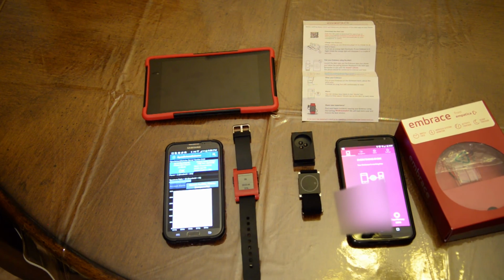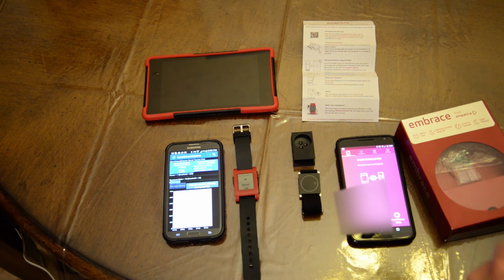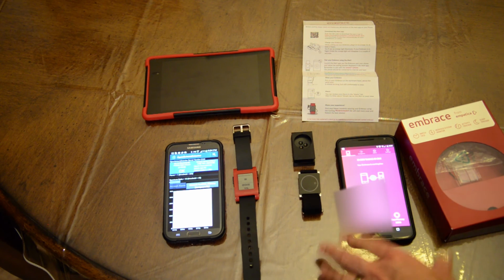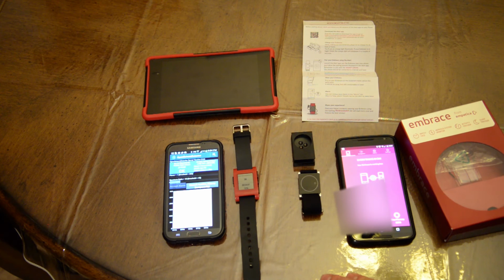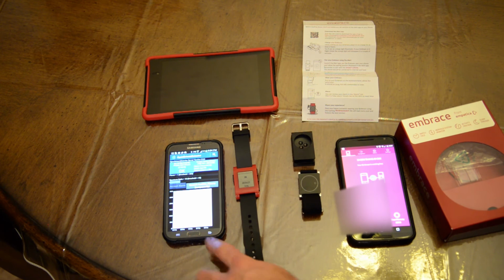This one's more for children. I only use it for my child at home and at night. I don't see any use for having this on my son outside, because he's not high functioning. He is non-cognitive. So we don't see him actually benefiting from taking either device with him. But this does have its added benefits. You can monitor to see how much movement he's making. This one is a cheaper value because you can use an older phone. But it does come with quid pro quos, correct?